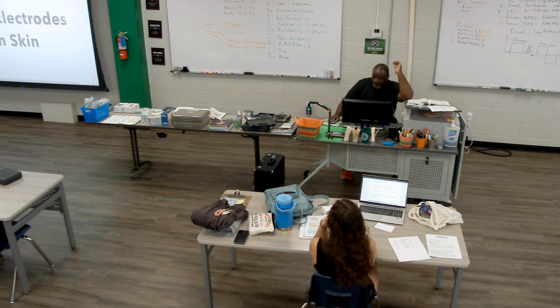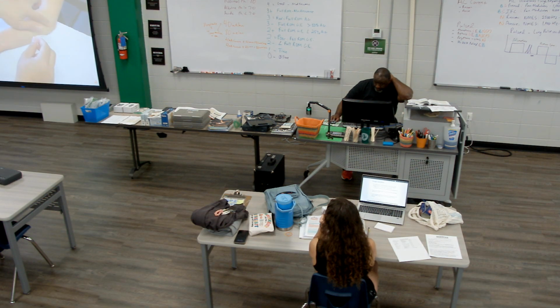Place the electrode with the medication over the target tissue, and make sure the electrode is in full contact with the skin. Apply the other electrode and prepare to connect the lead. Attach the appropriate polarity lead to the active electrode.